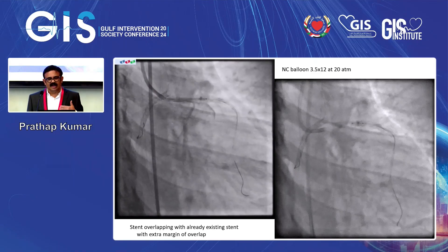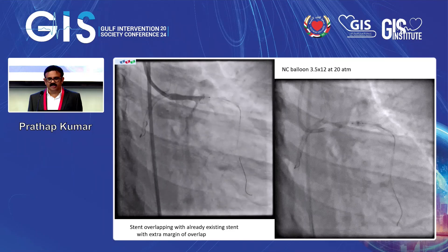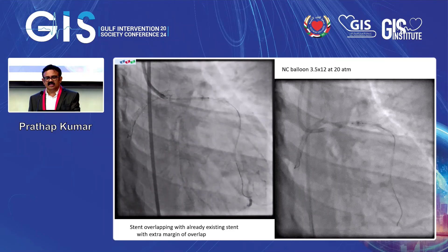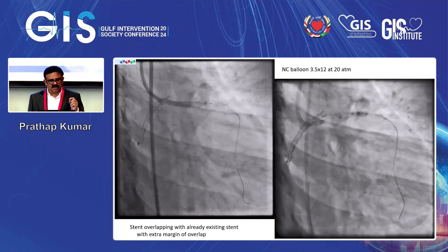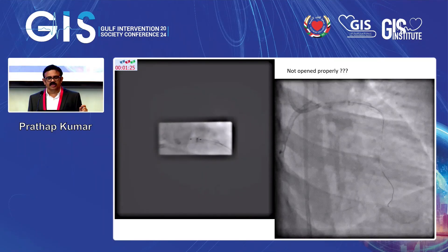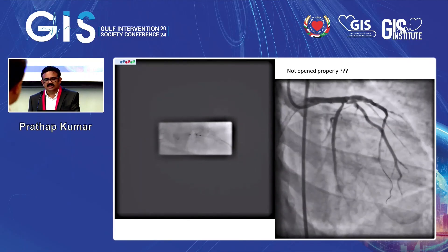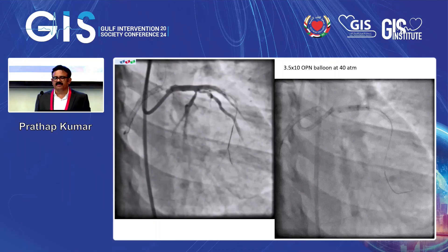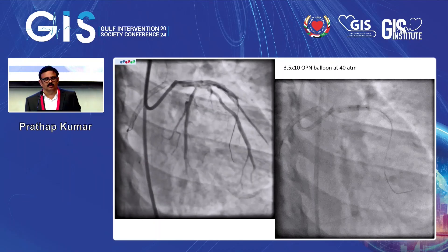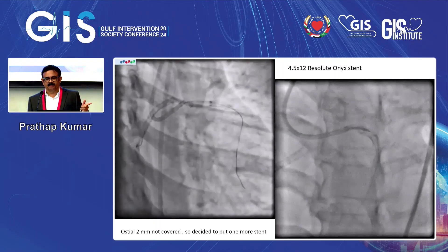My unluck — the NC balloon had a malfunction, would not inflate. You can see that part is not opened up. The overlapping stent with the already existing stent was not opened up. So I took a 3.5x10mm OPN balloon, went up to 40 atmospheres, and it opened up.